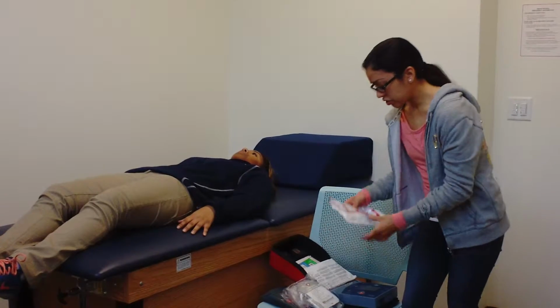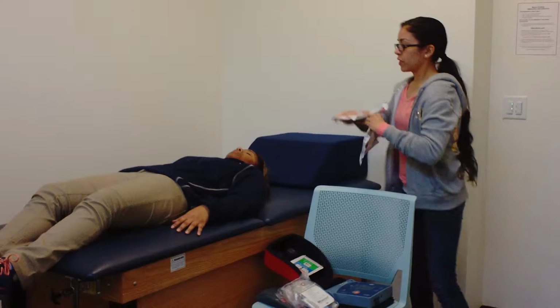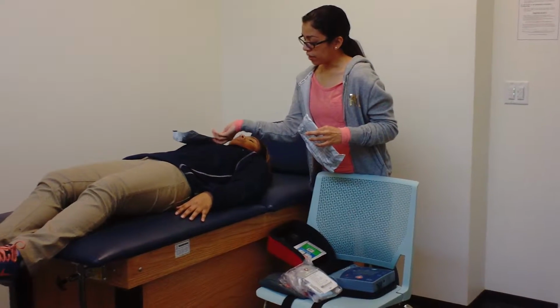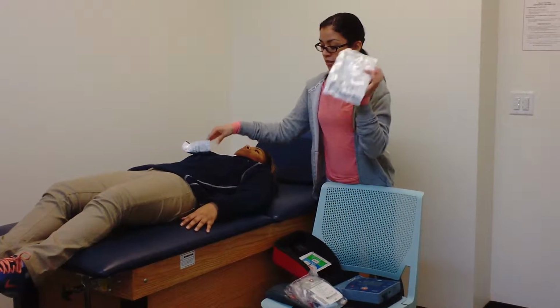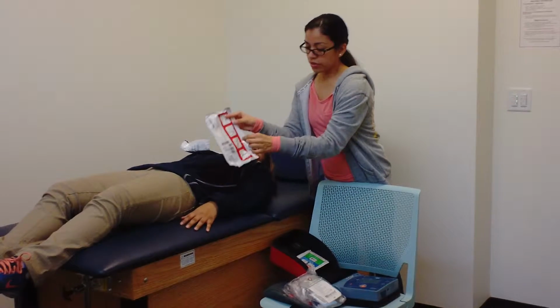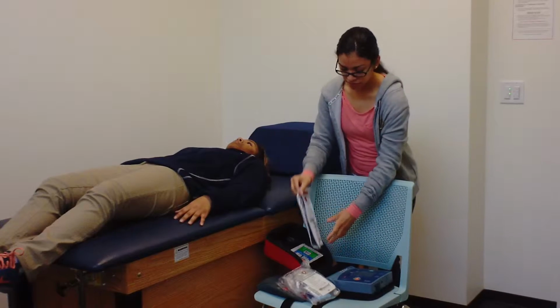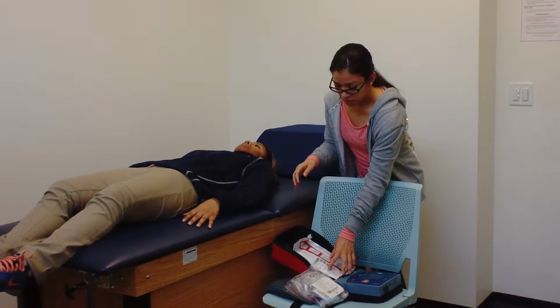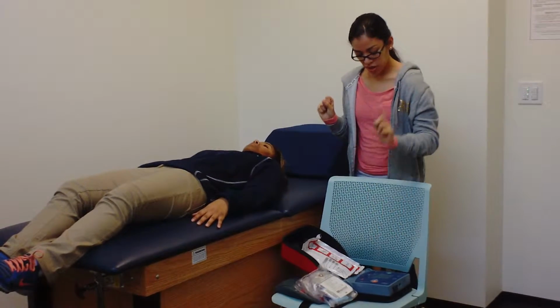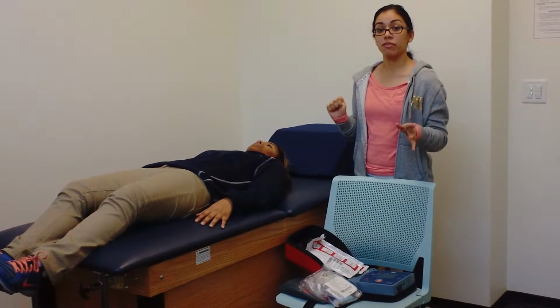So for the pads, they usually come in a bag like this. We would take them out, and the first pad would go above on the right-hand side, sort of on top of the patient's heart. The second pad would go on the left side, to the left of the person's ribcage. There is a wire that runs out of the pad, and we would connect that wire to the machine. Now, we want to make sure that we are not touching the patient and no one else is touching the patient.